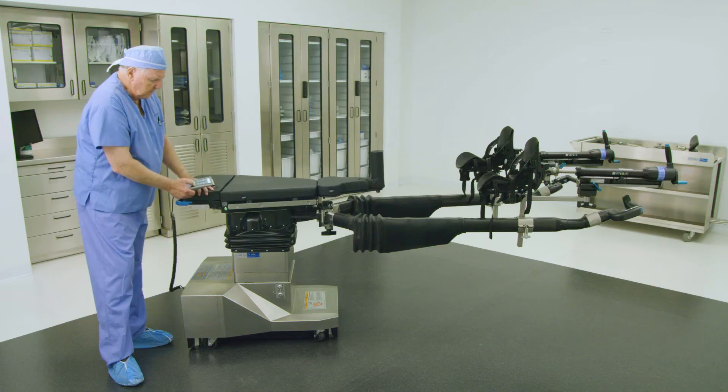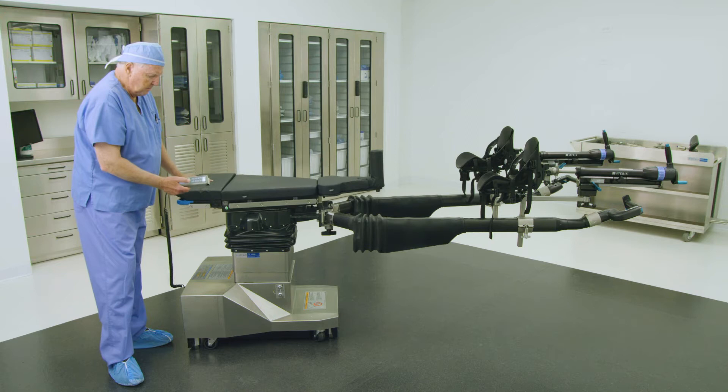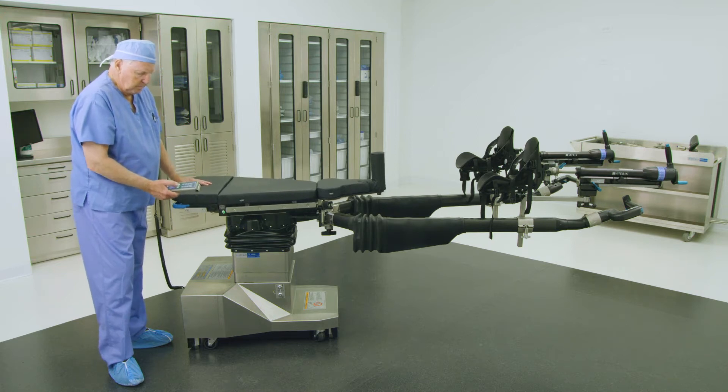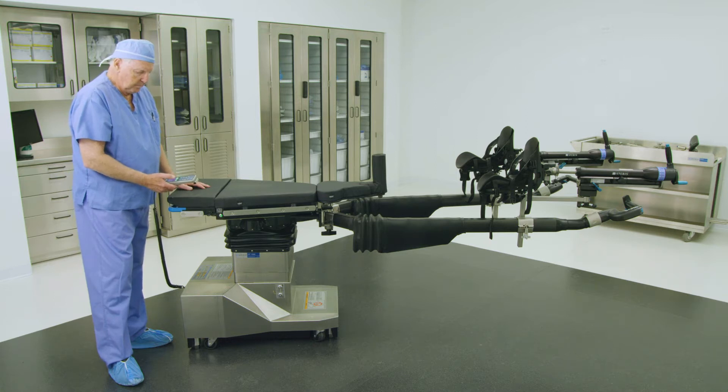The tabletop can slide in a transverse fashion from left to right to accommodate patient transfer onto and off of the table, to expose the surgical site, or to expose the anatomy for C-arm imaging purposes.